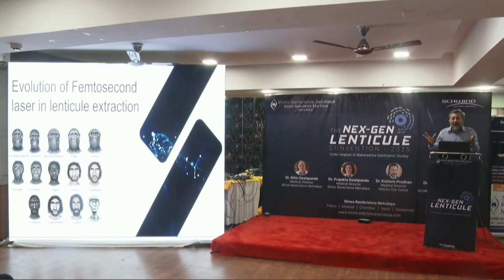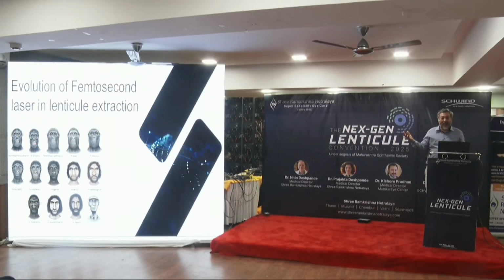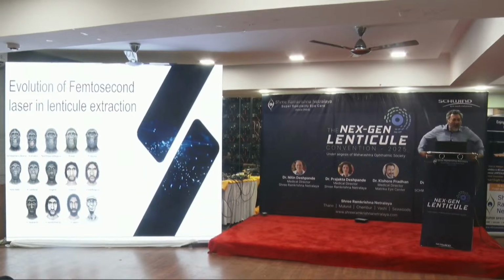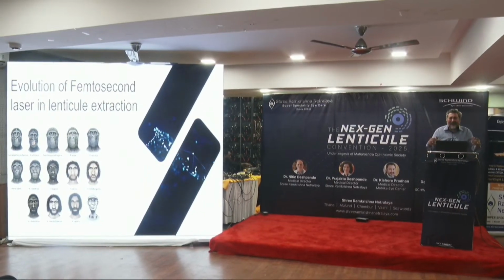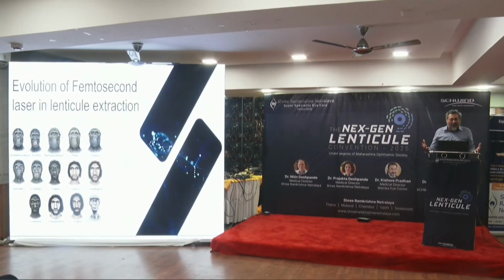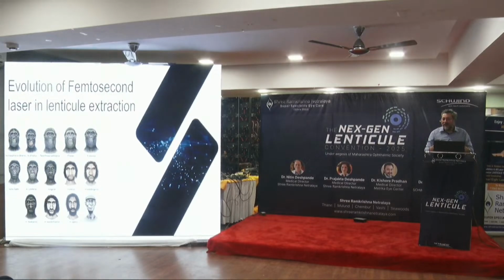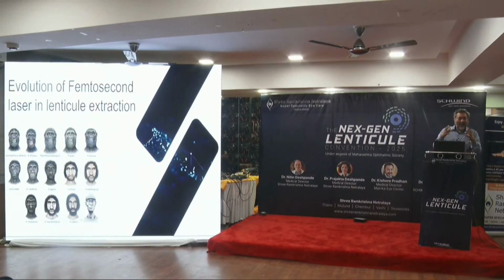And suddenly the trend, my professor was Dan Reinstein, London Vision Clinic. He used to keep poking me from behind. Do this. I said, it is so difficult, LASIK. Lift the flap up, do this, put the eye track on. Lenticule is so easy. And then I was the guy who started going all over Asia, like in China. You don't need to do LASIK. You can do SMILE directly. You can do lenticular surgery directly.